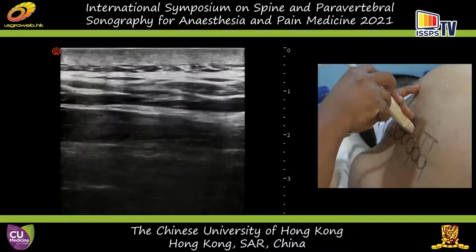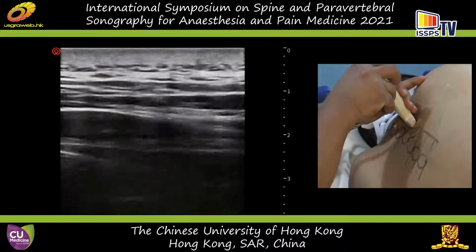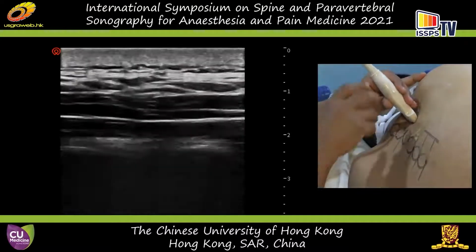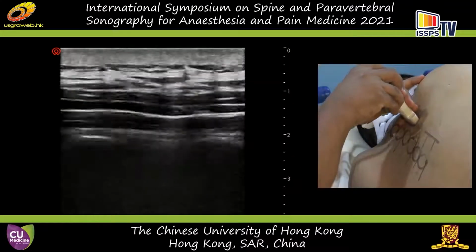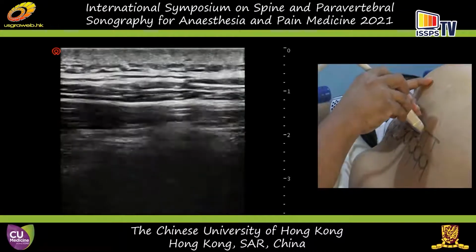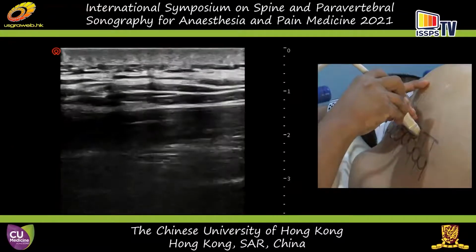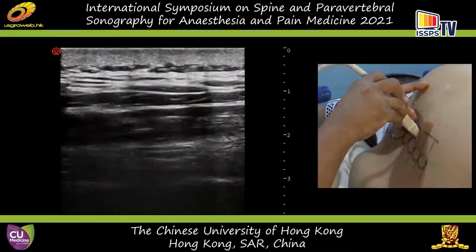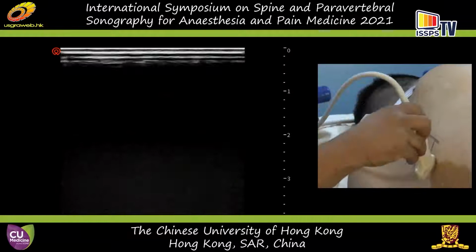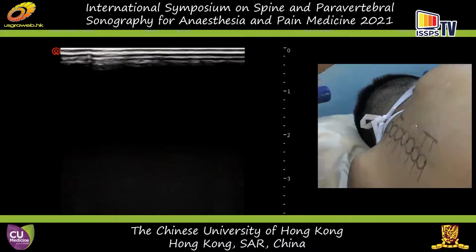And as you can see, ladies and gentlemen, even with good systems, sometimes visualizing the lamina can be quite a challenge using just the linear probe. So while the linear probe is quite useful in some individuals, it may not really fit the bill for every patient, as you can see here. So I'm going to switch over to my favorite, the curved linear probe, and I will show you the rest of the anatomy.